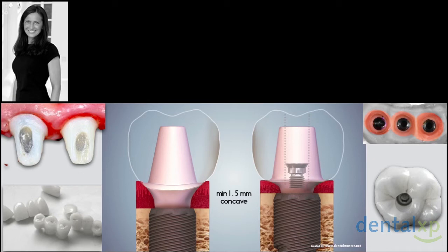If I have enough tissue thickness, so that the margin of the crown is only 0.5 millimeter below the free gingival margin, and I am far away from the bone, I can even cement with the vent technique or with a technique which reduces the cement in the sulcus. In any other case, we will take screw retained. When the soft tissue is thin, this would also be one criterion. And at least 1.5 millimeter from the bone should be concave.